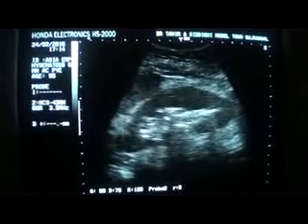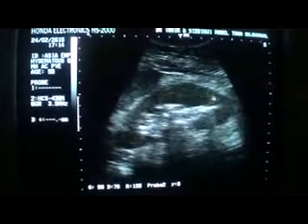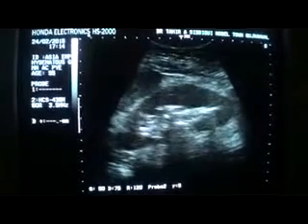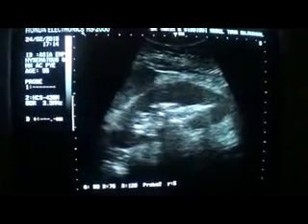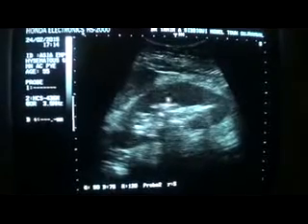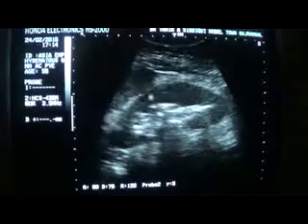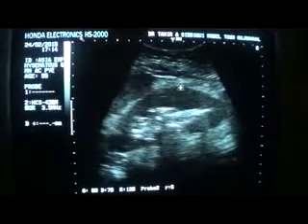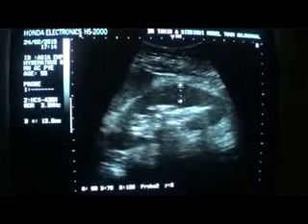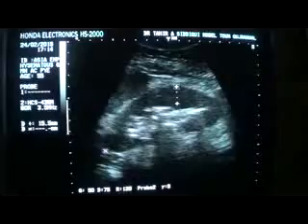Secondly, see that the parenchymal echogenicity is globally, diffusely decreased as compared to the normal kidney, if you remember what the normal kidney parenchyma looks like. However, the corticomedullary differentiation is intact. As you can see, this is the medulla, here is the medulla, this is the medulla. So corticomedullary differentiation is intact, as well as the parenchymal thickness is preserved at all levels.